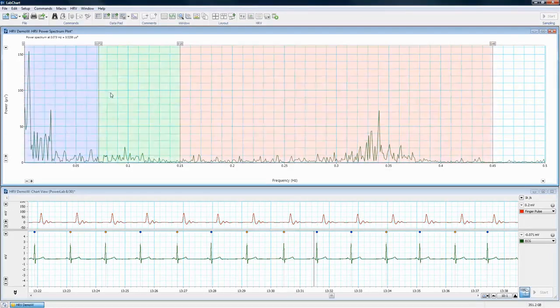with the mouse. Basically all I'm doing here is mousing over the top of it, left-clicking and holding, and dragging once I have that double arrow. When I go back the other way, I just need to grab a line for that previous version. So I can even put areas between. They don't have to be right up on top of each other. I can have dead space that isn't being considered any of the frequency bands, and then just drag them and butt them up against each other.